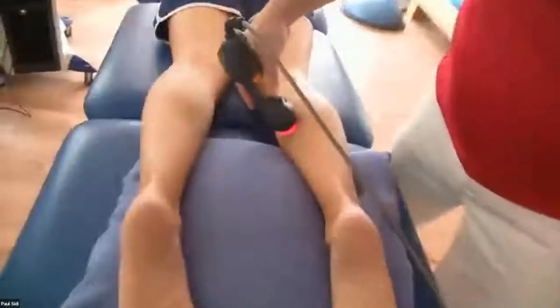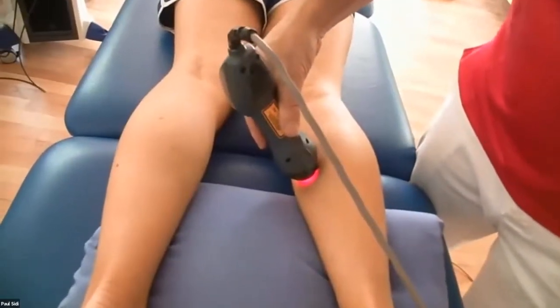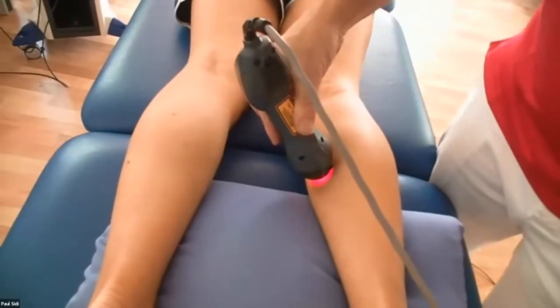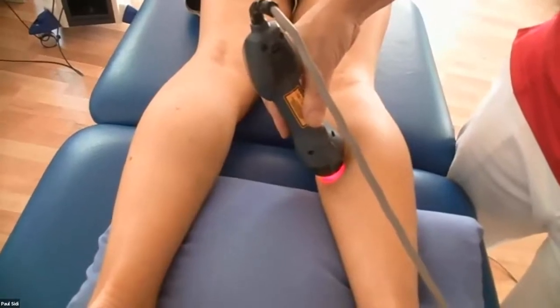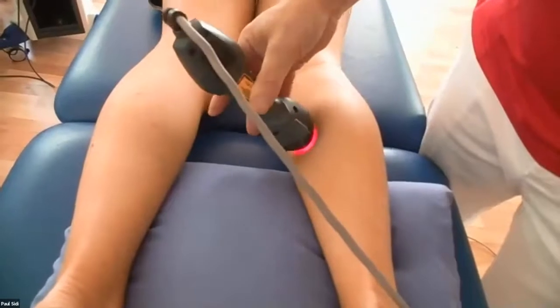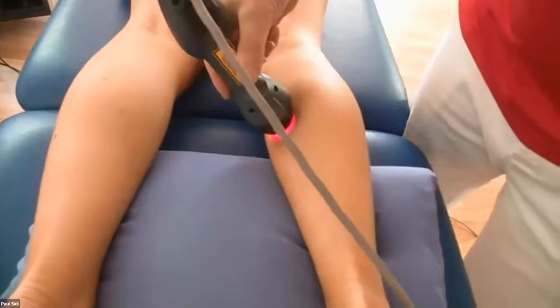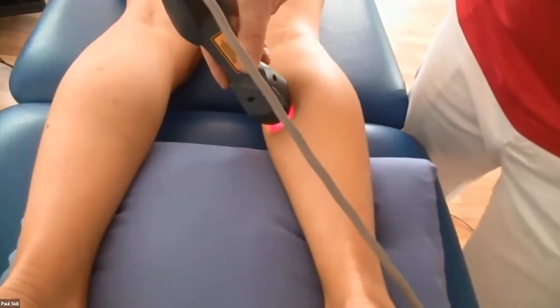Let's spin that around. So it's on there, 20 seconds. 20 seconds is a long time. Retesting that trigger point. Is that as bad as it was? No, it's not. Probably do 2 of those on there. Find any other trigger points, treat them, and after 2 or 3 of those, it will have gone completely. At 20 seconds, it's quite phenomenal.